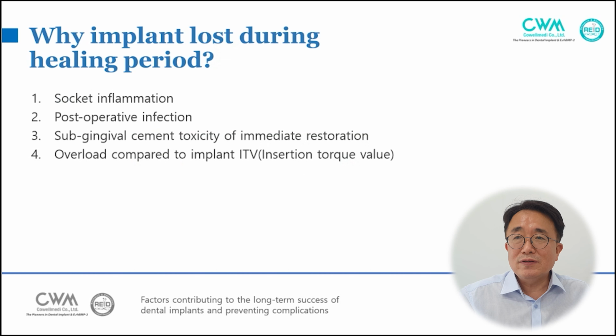Why is the implant lost during the healing period? First, socket inflammation, and second, post-operative infection. Third, subgingival cement toxicity of immediate restoration. Fourth, overload compared to the implant insertion torque value.